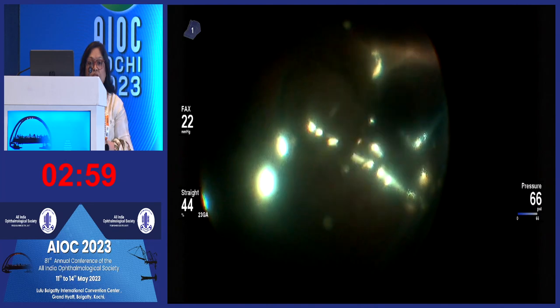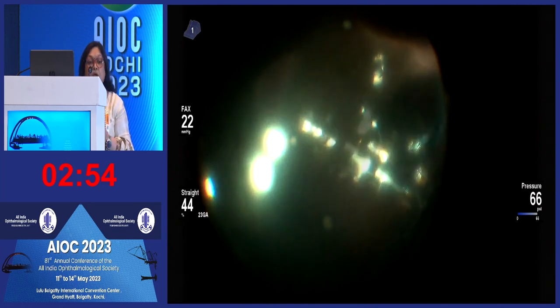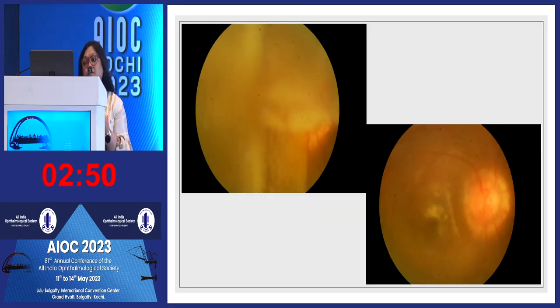Initially, because of the GRT, we couldn't see the optic nerve very well in this patient, but eventually the optic nerve was like a morning glory syndrome. So this was the pre and the post-op of the patient, and you feel a little happy when you are doing this with a phakic patient and with a clear lens. In such cases where the entire pars plana is off, you're always wondering how to get your infusion cannula inside.